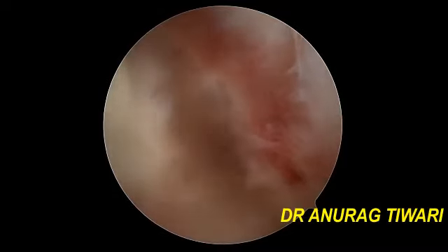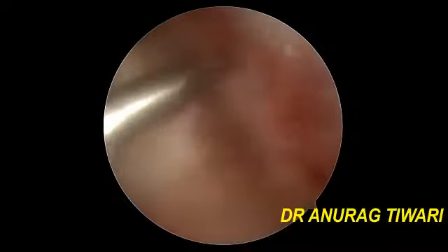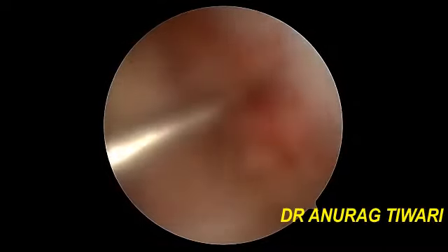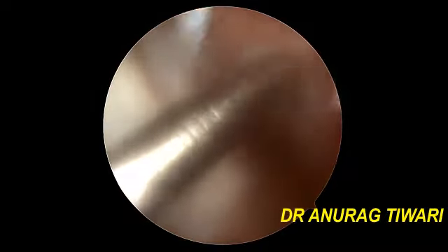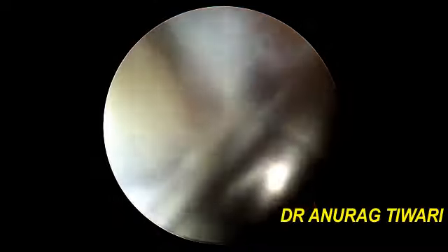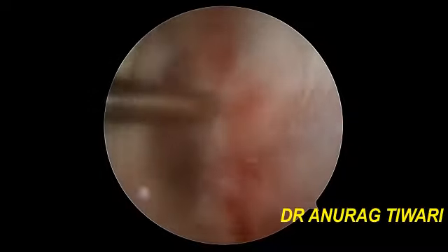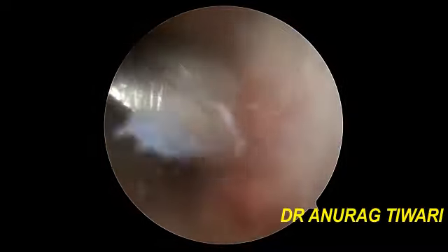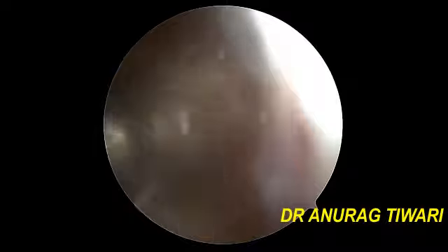And now you will reinsert the guide wire or the bead pin through the same hole, and over this bead pin you will run the reamer of the appropriate diameter. So whatever the diameter of your graft is, in this case it is 9 mm. So I will just use a 9 mm femoral reamer. The femoral reamer is of flower tip. So over this guide wire I will insert the 9 mm femoral reamer and will ream the femoral socket.